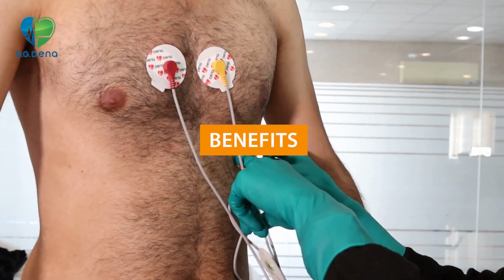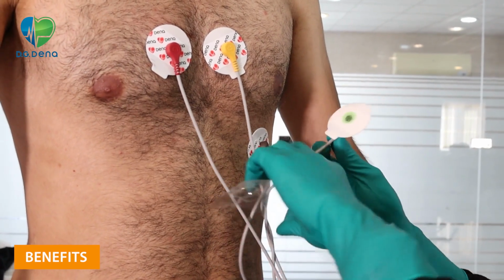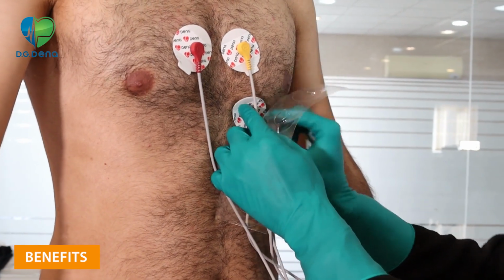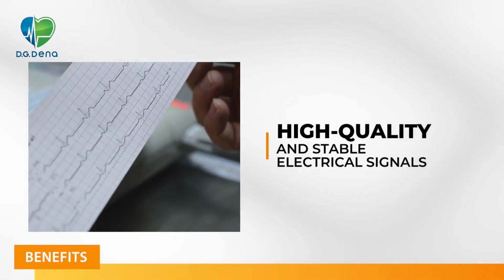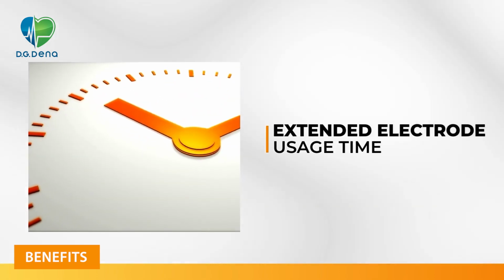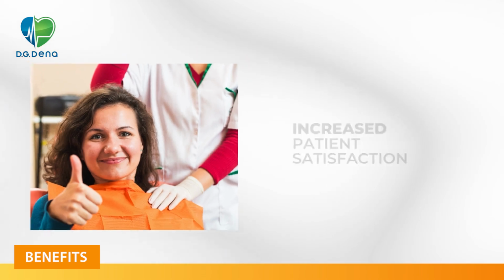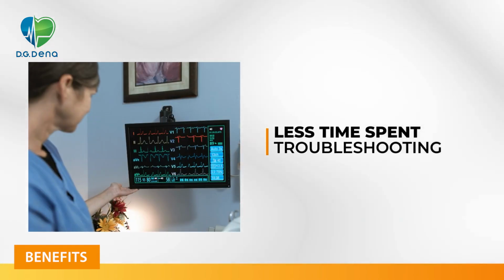Benefits of proper electrode preparation and application. Correct skin preparation and electrode placement, which takes only a few seconds, provide numerous benefits for both healthcare professionals and patients, including high quality and stable electrical signals, better electrode adhesion, extended electrode usage time, reduced frequency of electrode replacements, increased patient satisfaction, less time spent troubleshooting weak signals, allowing staff to focus on other tasks.